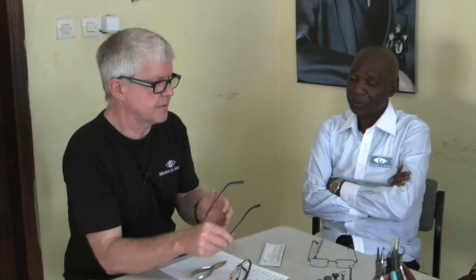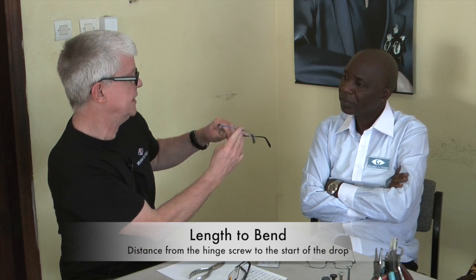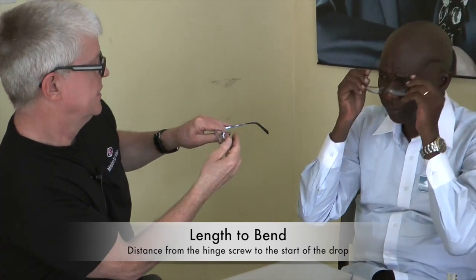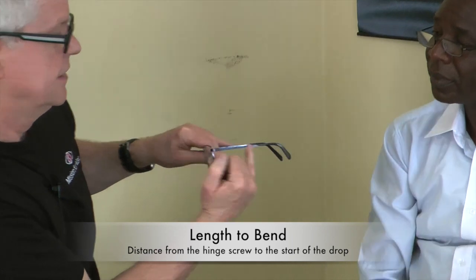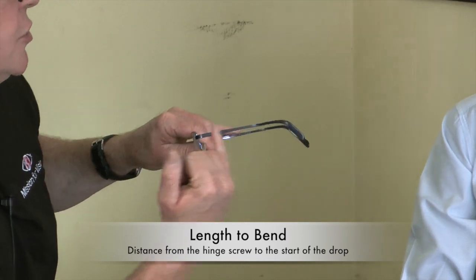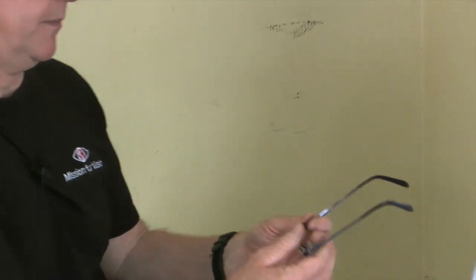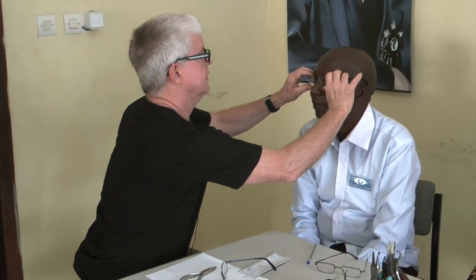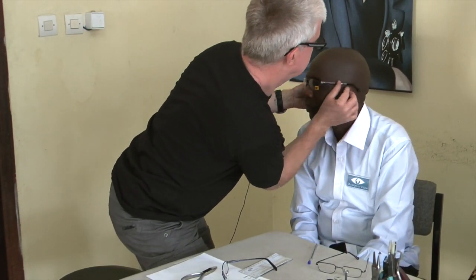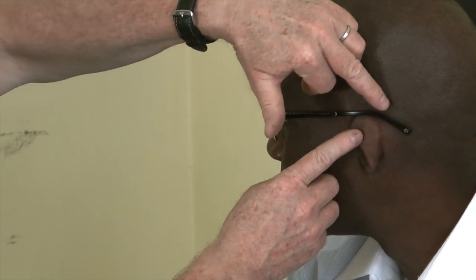The other adjustment that is important is the length to bend, which is the length from the hinge here to where the bend is. You can make the side longer or shorter in some cases. Let's put this frame on Remy. In this case, we can see that the side, the bend, is a little bit too far away — so that is a bit loose and will slip.